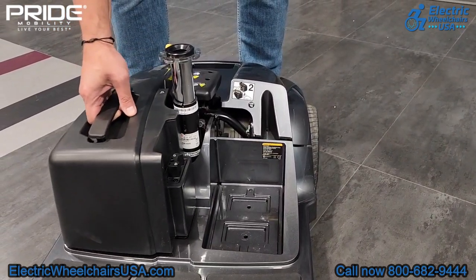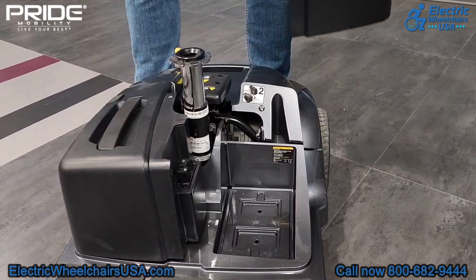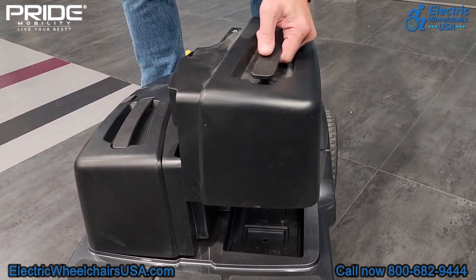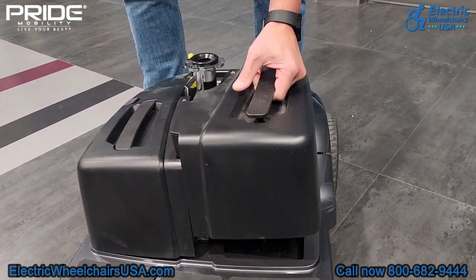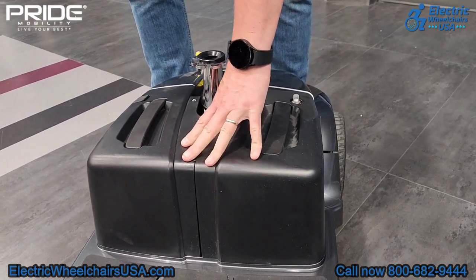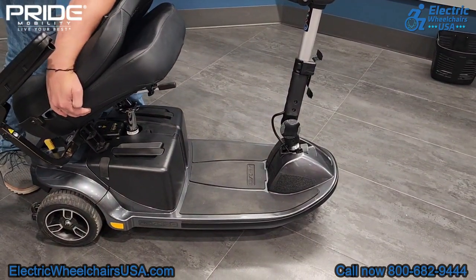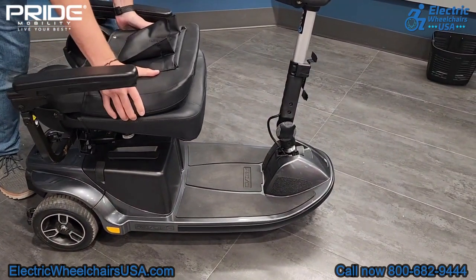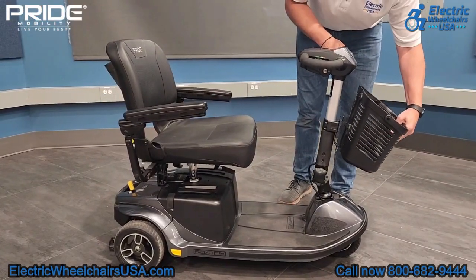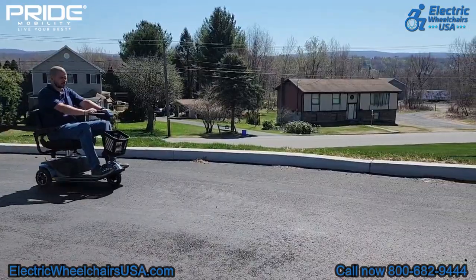Now, if you're sitting on the scooter or you're right behind it, you have to put the right battery on first. And once you do that, you can see there's a couple metal connectors here, and then the second battery would be added second, and they kind of fit together like a puzzle. So you have to take it off and then put them back on in the same order. The next step is you would line up the peg on the bottom of the seat with the seat post and just drop it in there, put the seat back up, and lastly, put the front basket back on. And now you have reassembled the Revo 2.0.